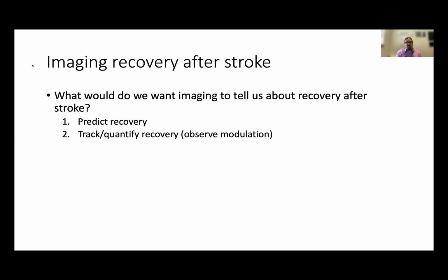Even better would be if we could actually track the recovery, if we could quantify it in some way, and then potentially even observe modulation should we be able to modulate recovery. That's another piece that we might ask for. And then ultimately, with all these imaging biomarker type research, we really hope that this imaging is going to elucidate the mechanism. So we hope that we will be able to learn from what we see on the imaging, understanding what that imaging represents at the cellular level, and then take that into our understanding of what's happening pathophysiologically.